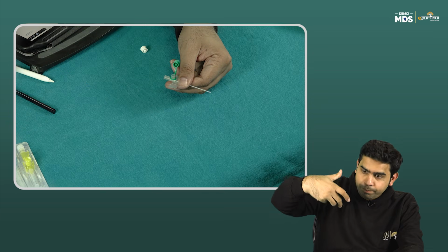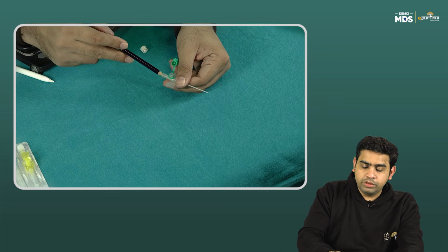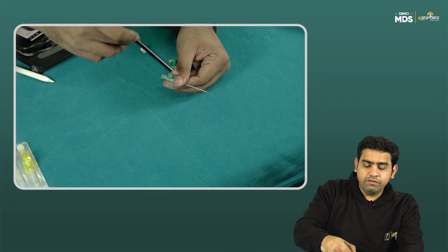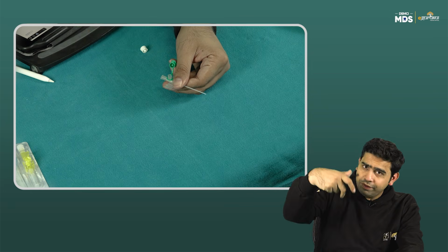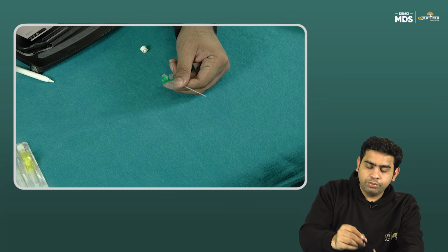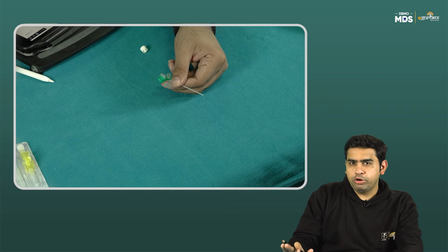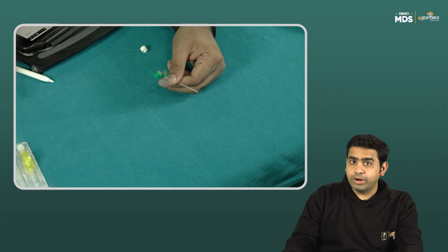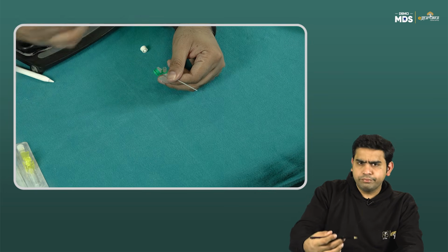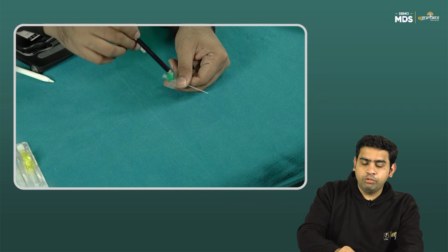Why? Because when you push it, you might push it with force, and if you push with force from this, the cannula can rupture that vessel. But if you put it from here, even if you push with force, it is going to hit the base of this and it won't rupture, because the pressure will not get transmitted into those small vessels. I hope you're able to appreciate. So just teach the next sister you come across. If you find somebody giving the injection from here, take a chance to explain why it is ideal to give the injection from the above injection port rather than this.